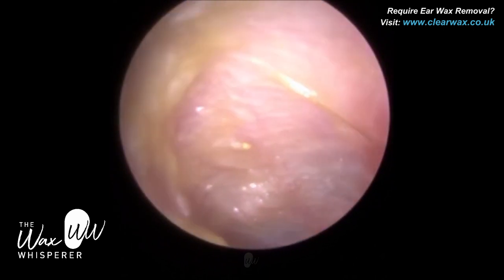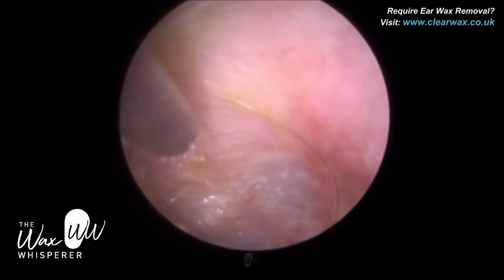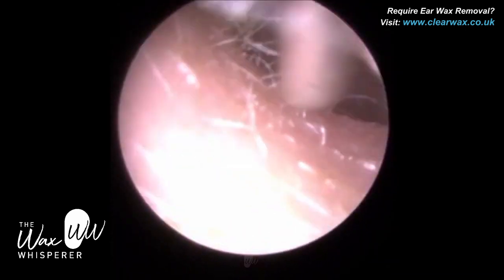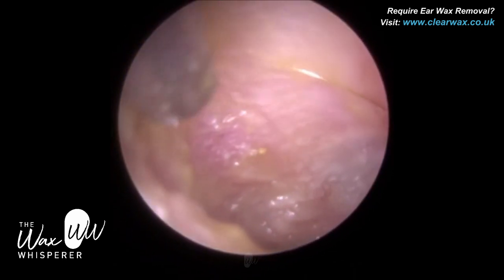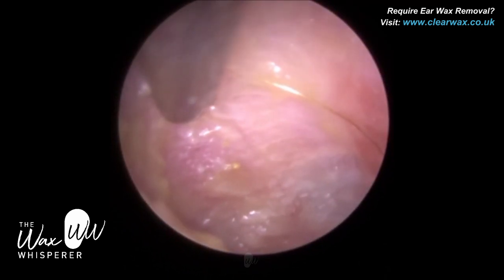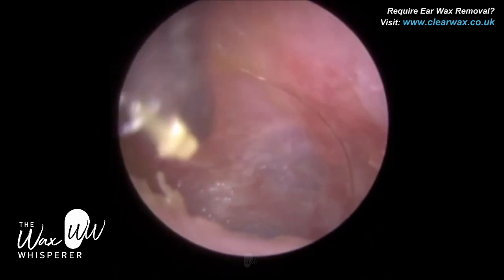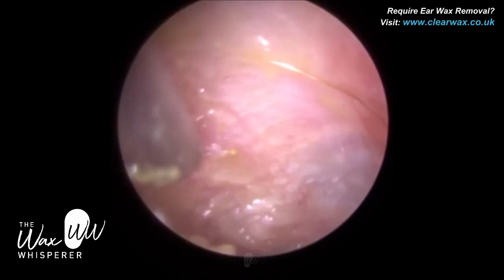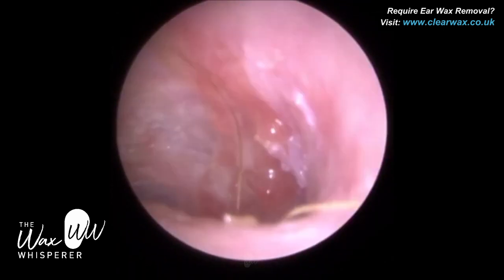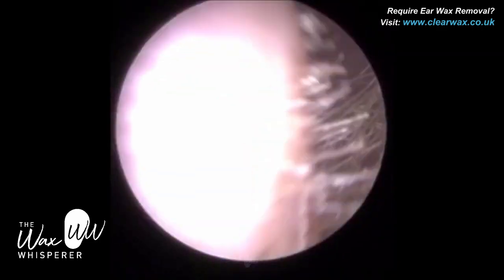You can see the granular myringitis on the eardrum now. I'm just trying to remove some dead keratin and infected dead skin off the top part of the eardrum — the attic — and also the roof of the ear canal superiorly. I've been fortunate to work closely with an ENT consultant surgeon colleague during my microsuction training, and I spent a lot of time at an NHS private clinic performing procedures like this. One of the best treatments for an ear infection, if antibiotics aren't working, is simply to clean as much dead skin, debris, and discharge off the ear canal — it gives it a chance of recovering. That's the patient's eardrum — you can see all that granular myringitis.